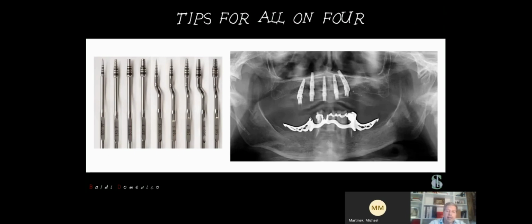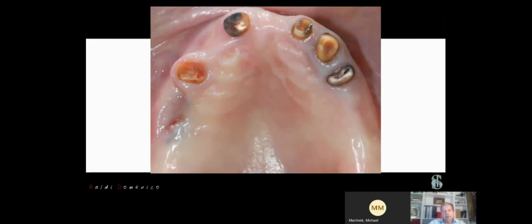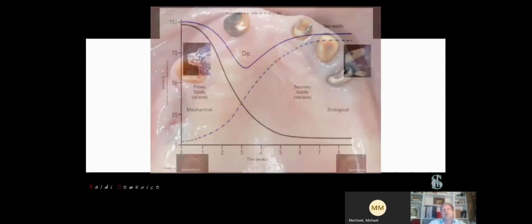And again, we can start from this clinical situation. So we have to make the extraction, and if we want to make an all on 6, all on 5, all on 4 after the extraction, we need to be less invasive, less traumatic during the extraction in order to maintain, to preserve the bone where we want to place our implant.